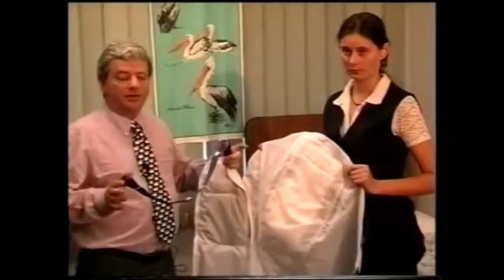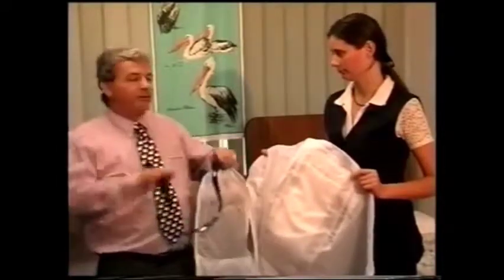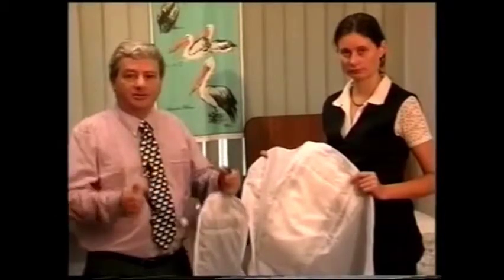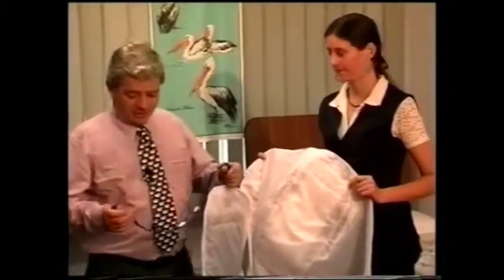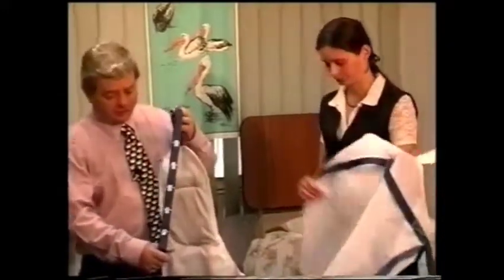Before, when they were in a reclined position, they're scared that they're floundering and falling out of it. But now that they're sitting upright, they can hold on to the straps and they can participate in the lift itself. Now, we've got here, can you come in on this, and I'll just show the numbering.